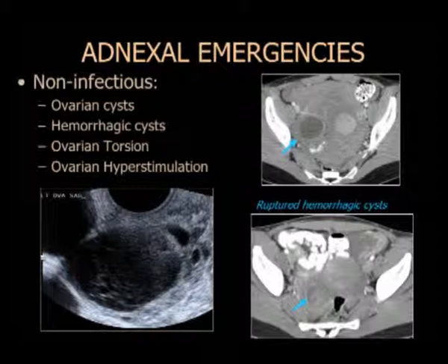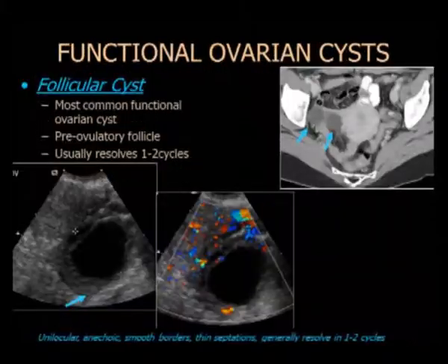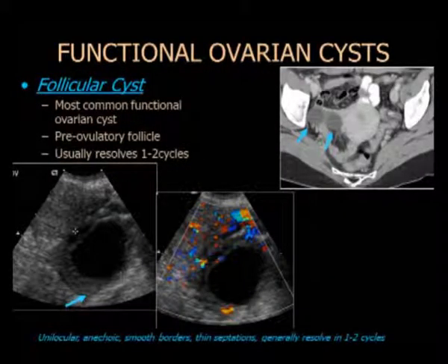Pasemos a las emergencias anexiales. Hablaremos de las no infecciosas antes de las infecciosas: quistes ováricos, quistes hemorrágicos, torsión, e incluso la hiperestimulación. Hay que recordar el aspecto normal en estas imágenes. Los quistes foliculares son muy comunes en el folículo preovolatorio; esto remite en un par de ciclos. En la TAC, si está bien definido y no se ve pared, esto remite con seguimiento.